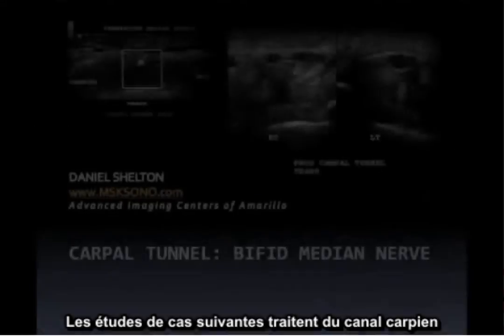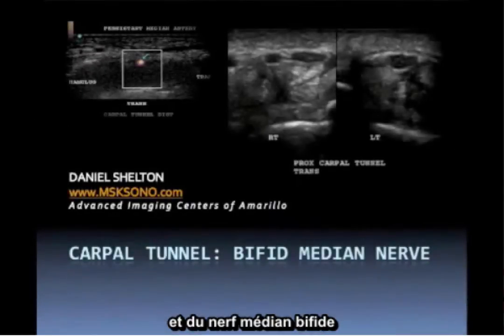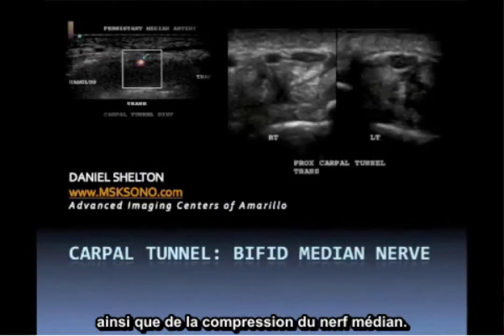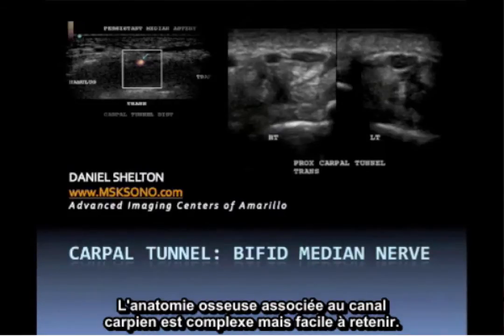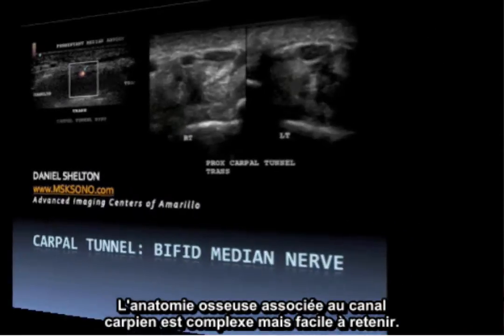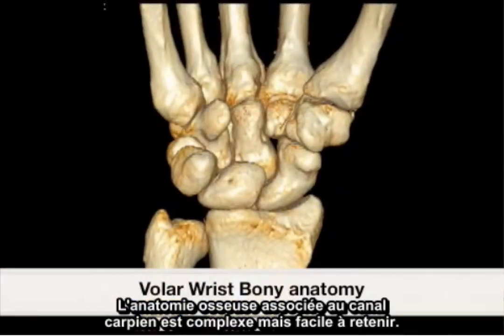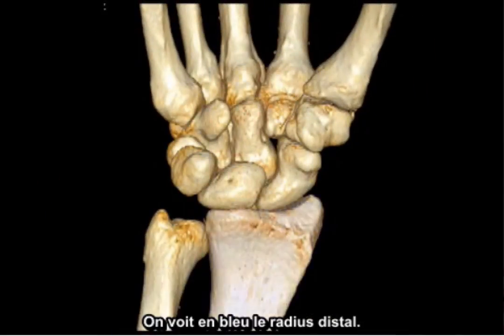The following are case studies of the carpal tunnel, also including a bifid median nerve as well as median nerve compression. The bony anatomy associated with the carpal tunnel is complex, but not difficult to learn.